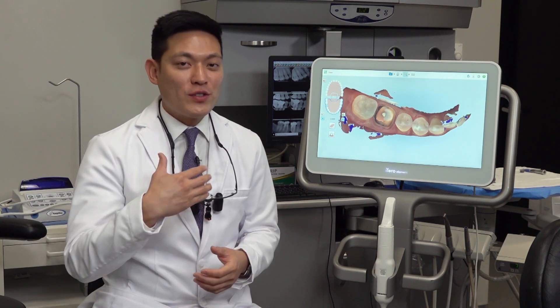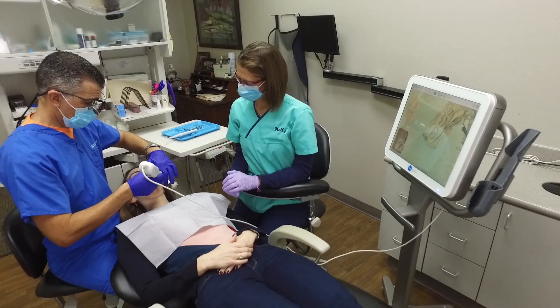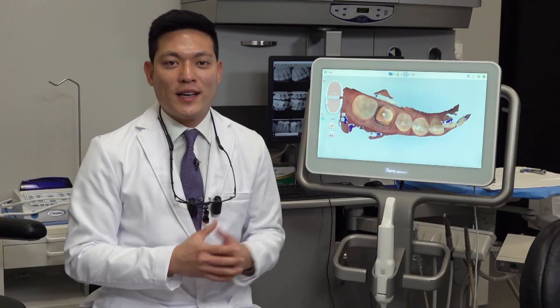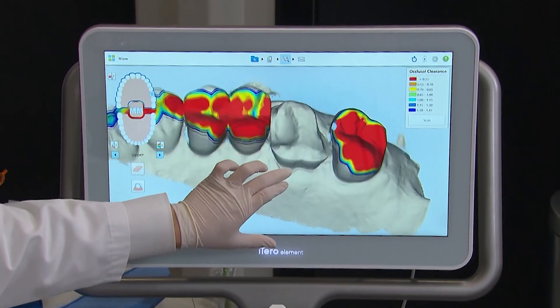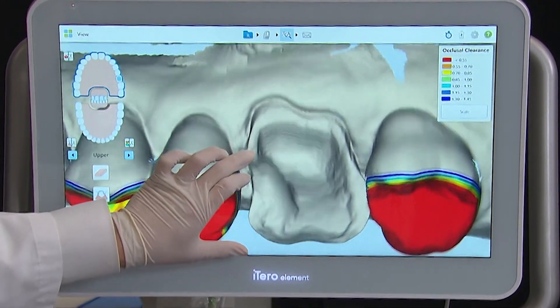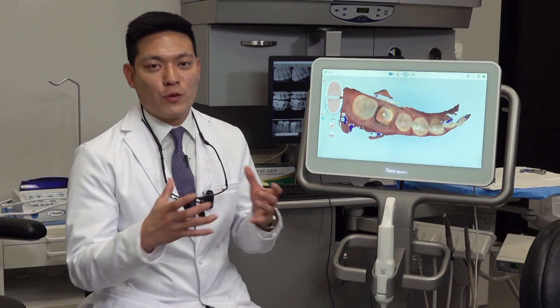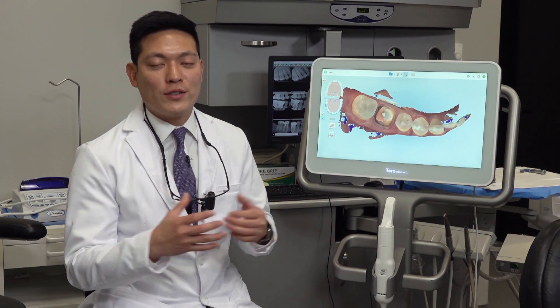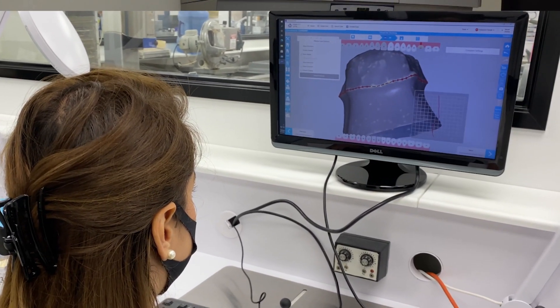So you've captured your digital impression. Now before you send it off to the lab or to whatever service you're sending the STL scans to, you want to make sure you analyze your digital impression and digital models first, to ensure that you have all of the critical data points that the lab will need to create a precise fitting, accurate restoration.